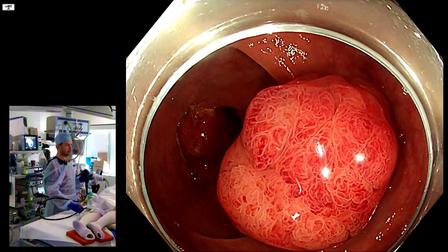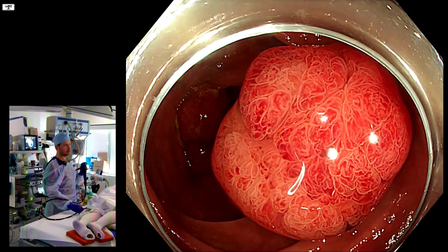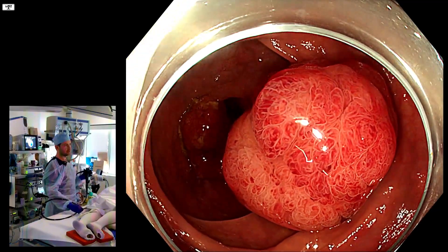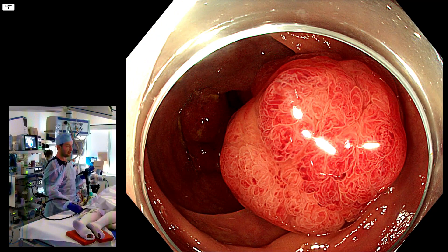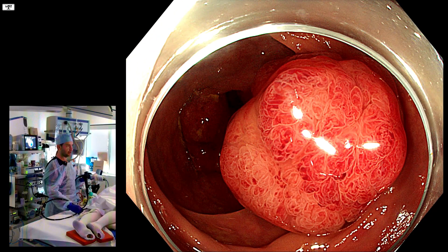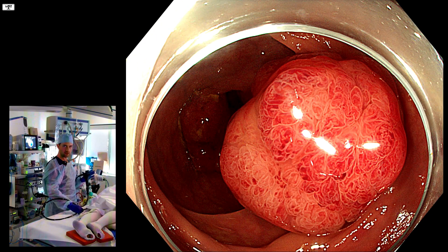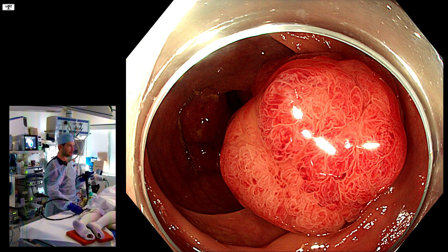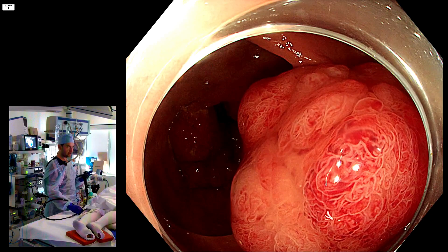Two or three polyps in the rectum. Look at the first one. Look at the structure. If you're not sure about something, freeze it. Don't just sit there and let it move. Right now, you can properly analyze it — your brain's really focused on the structure.